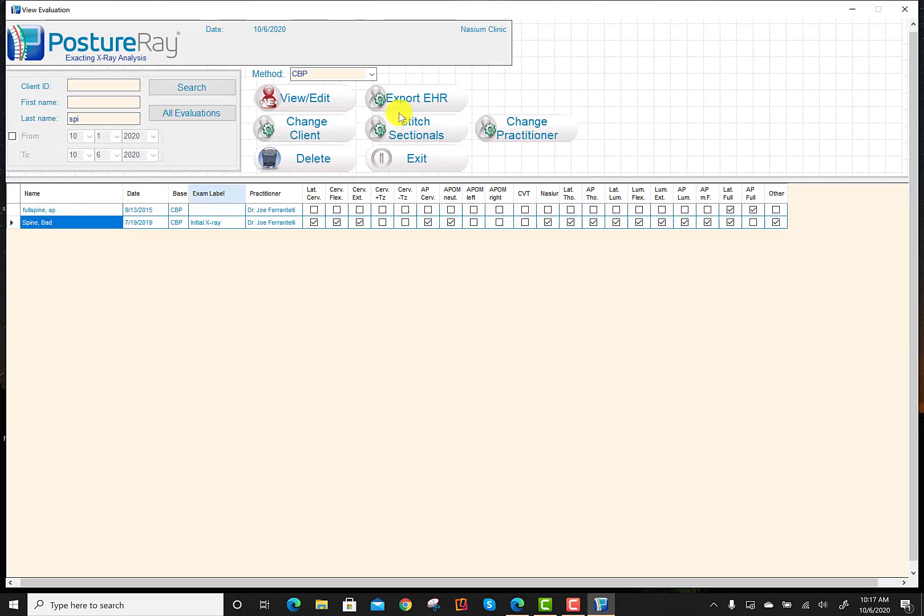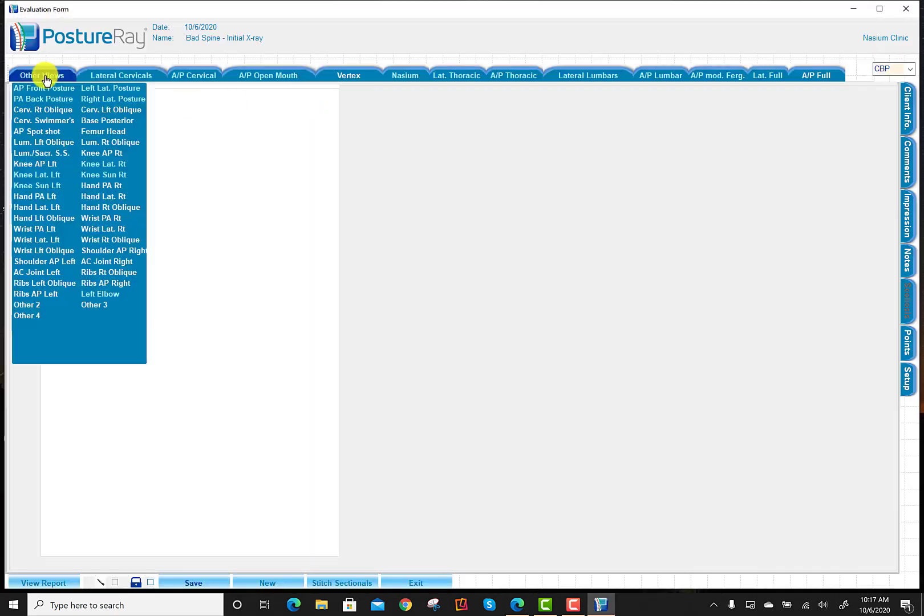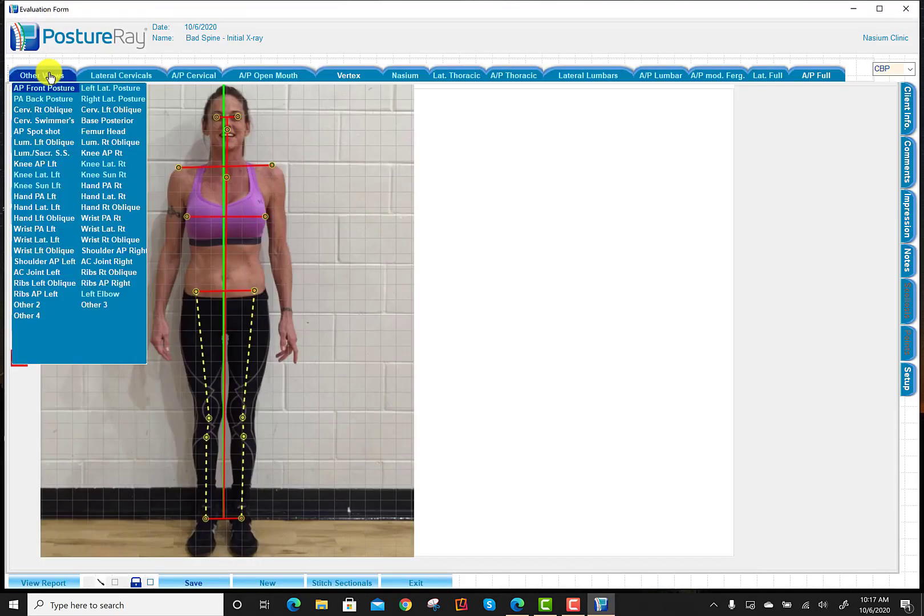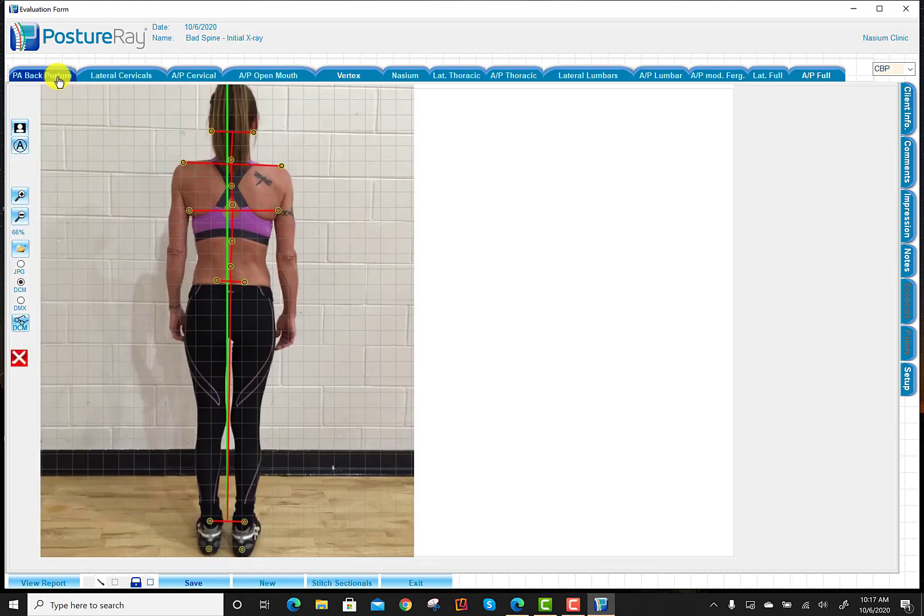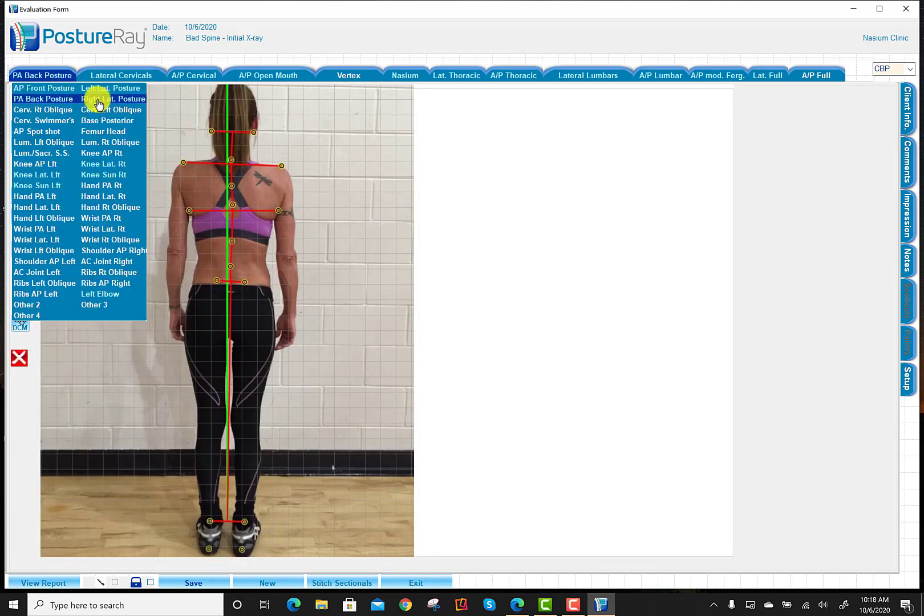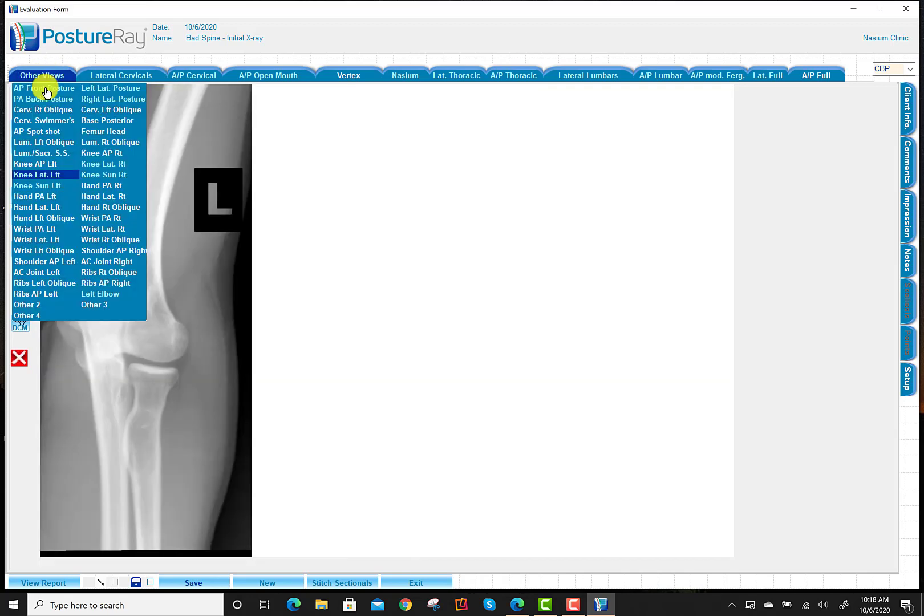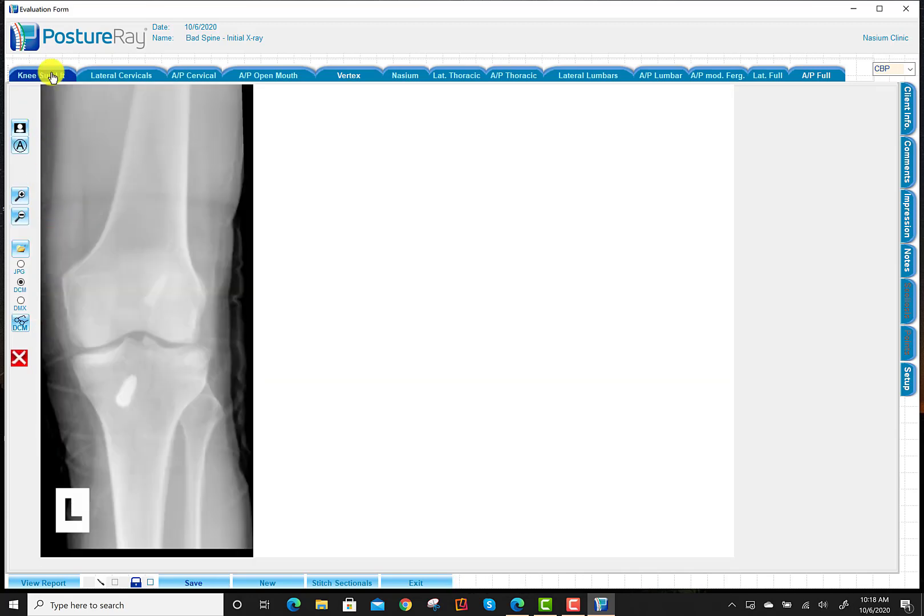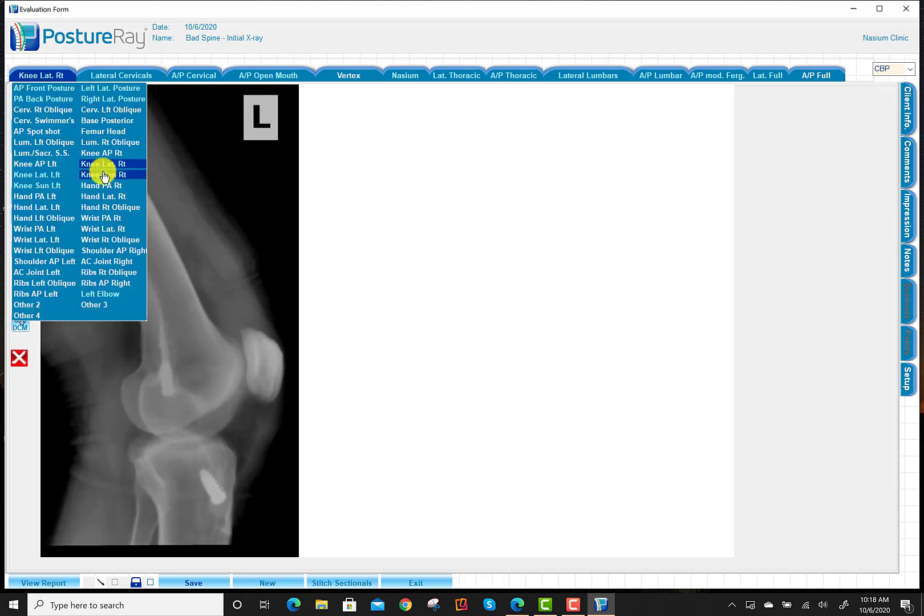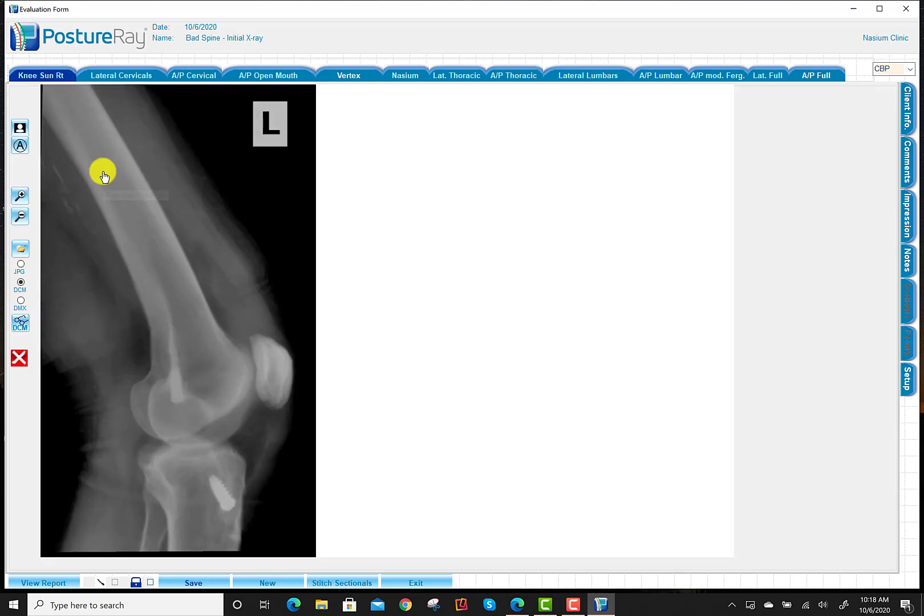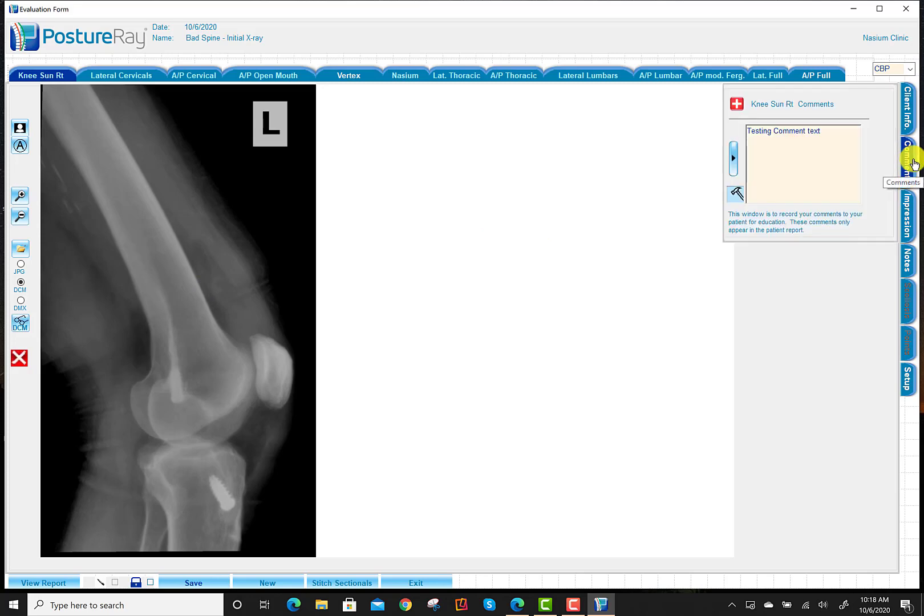So in this case, I have loaded additional x-rays. Not only do we have postures in here, but you can also see that I have pictures of knees and other things that we're not necessarily going to digitize, but we might want to export them and manually upload them to our EHR.